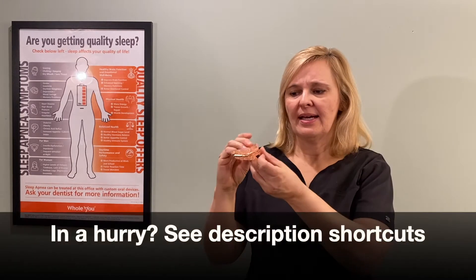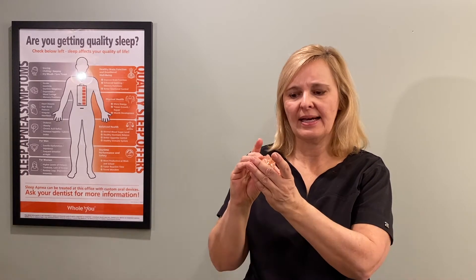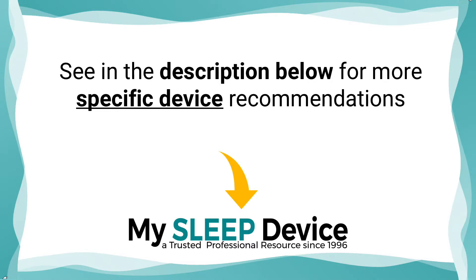This is what it looks like. It has two movable top and bottom pieces with arms on the side, giving a lot of lateral movement. It's a great device. Make sure you check the resource link for this particular device for the cleaning instructions and a lot more specific information regarding this device.